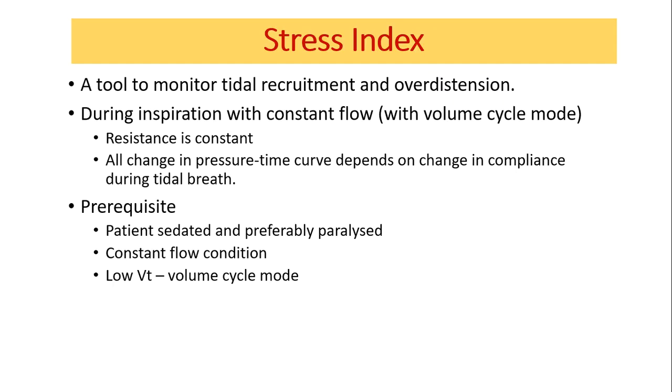Stress index. Now this is also something some people like to ask. I don't think anybody uses it, but people like to ask. It is a tool to monitor recruitment and overdistension. And how is that tool used? In a volume control mode, wherever the flow is constant.